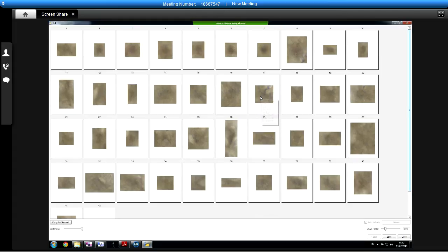So what I'd say straight away is that most of the ones that you're considering true positives are between about just above 35 and nothing really higher than about 65. So that's a bit of information we could use to help.